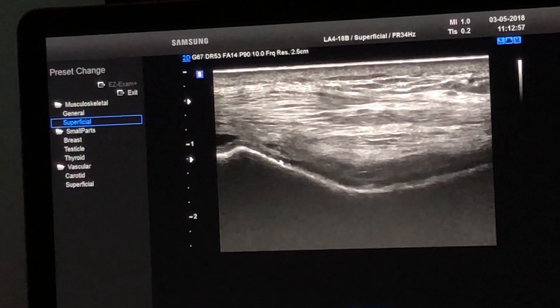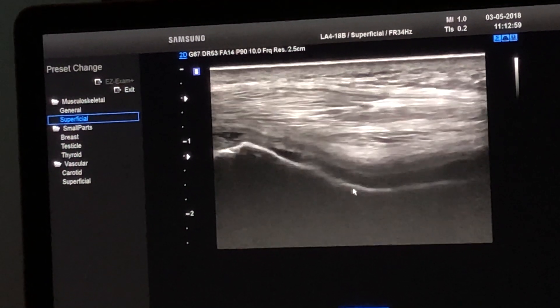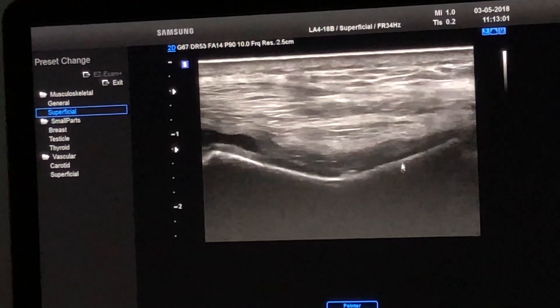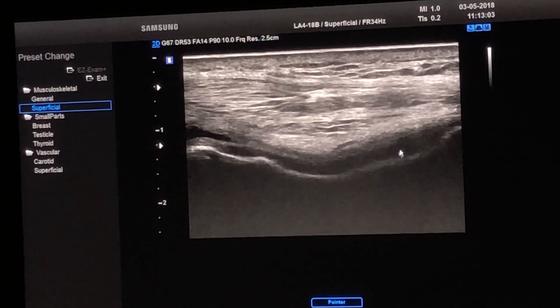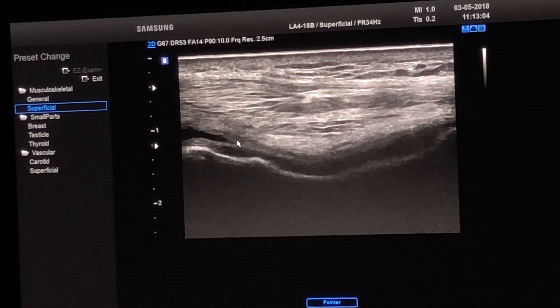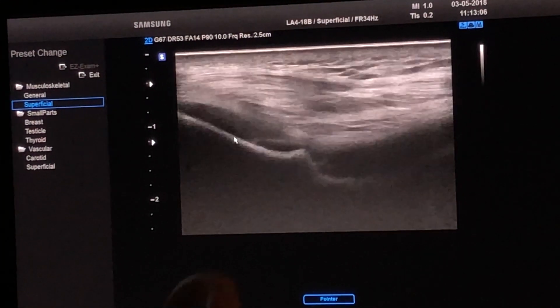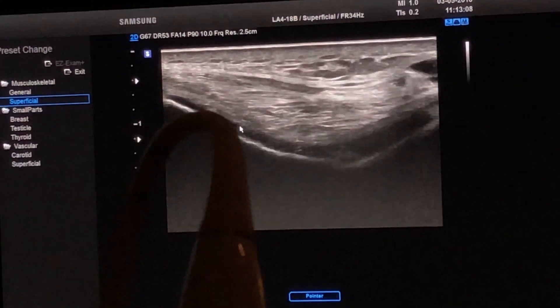There are other problems in this case. You see the cartilage — the cartilage is very thinned here. Any time you check the trochlear surface, you should compare the lateral and the medial side.